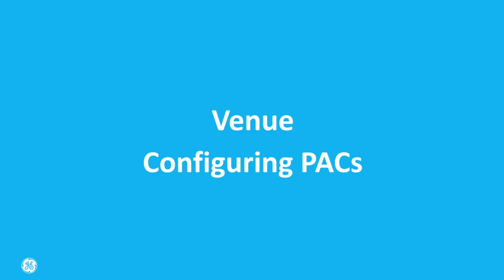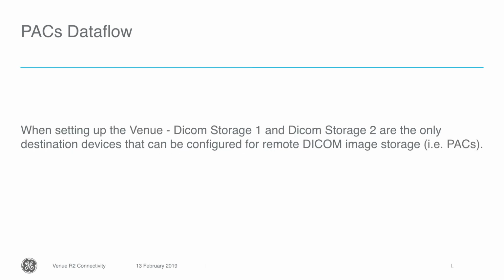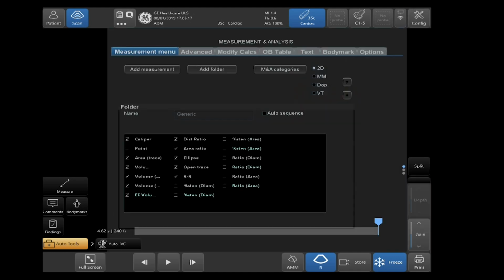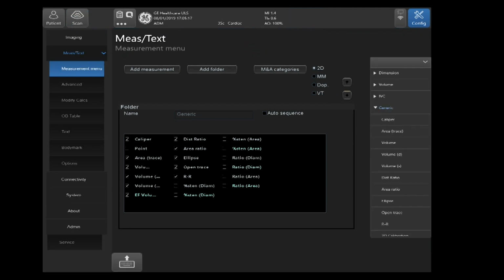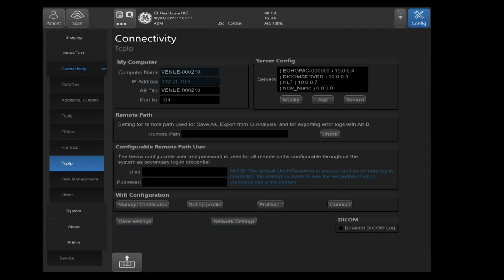PACS configuration. On your scan screen, go in the upper right-hand corner, select Settings, select Config. On the left-hand side, go ahead and select Connectivity, select TCP/IP. Over on the right-hand side of your screen under Server Config, go ahead and select Add.